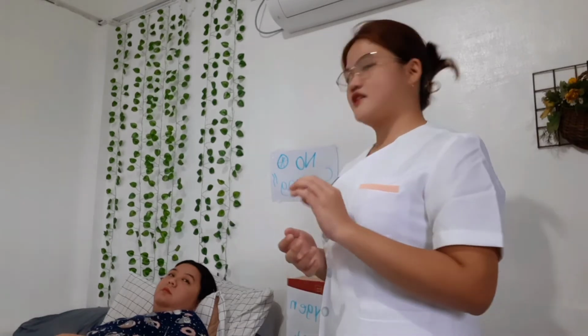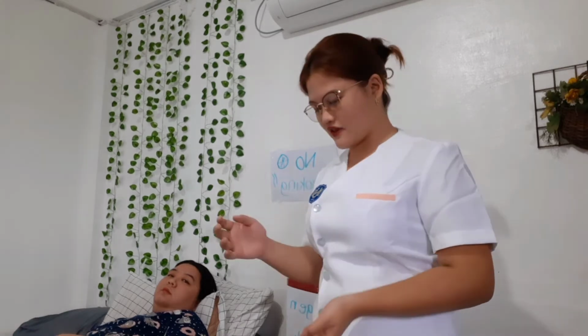So, what is the rationale for preparing the materials needed? Organized materials and equipment save time and energy, so it facilitates accessibility during performance of the procedure. Another thing needed is the nasal cannula, with hypoallergenic tape as needed. Then for the face mask, I have here only the simple face mask, which is prescribed in the appropriate size.